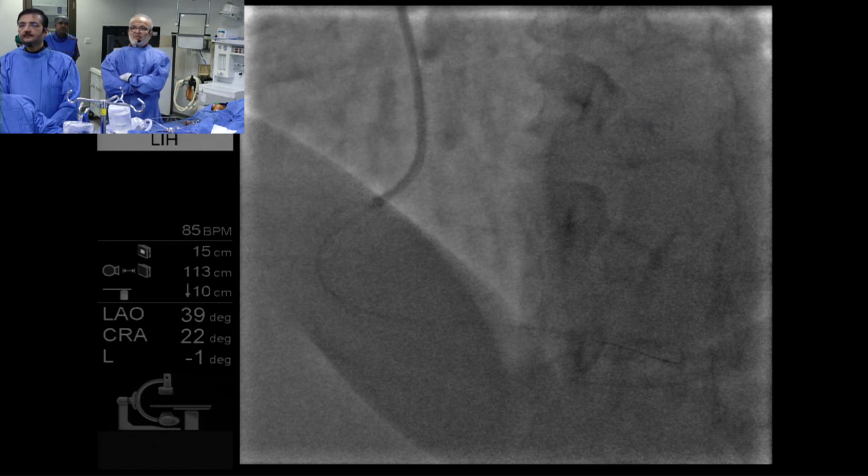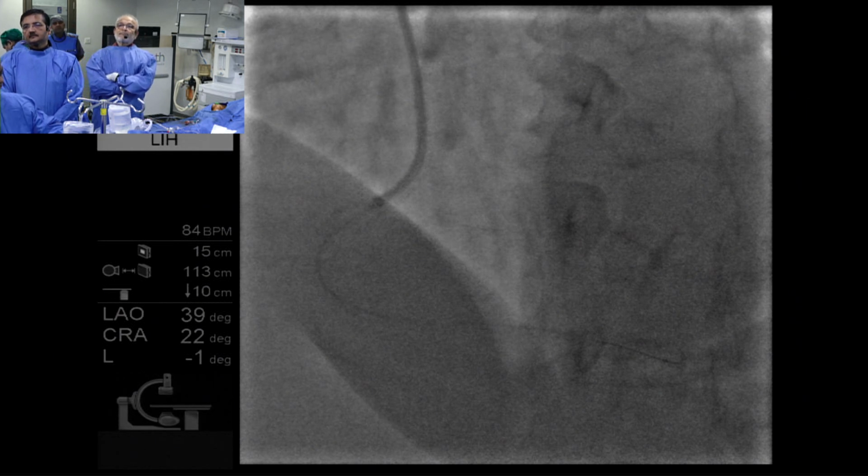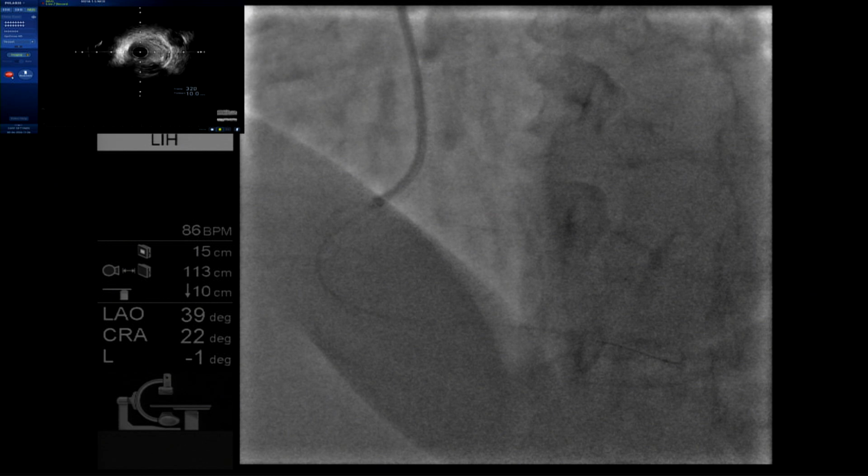Professor, your comment. This is a PDA, right? Almost normal or some fibrous plug can be seen, right? And here is a trifurcation, right? Yeah. Nodule. Nodule. Yeah. And then the distal, just proximal to the bifurcation, still has some protrusion and nearly 180-degree calcium, and then becomes very normal, right?